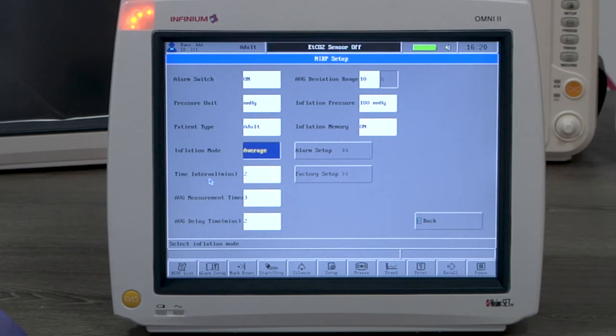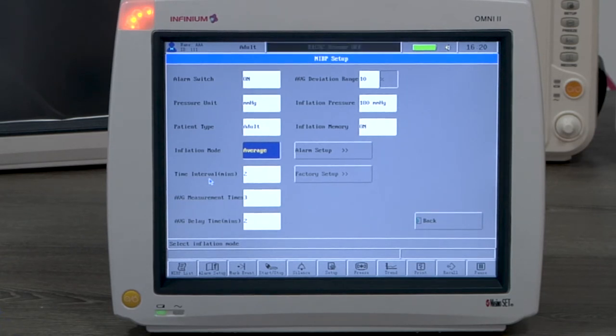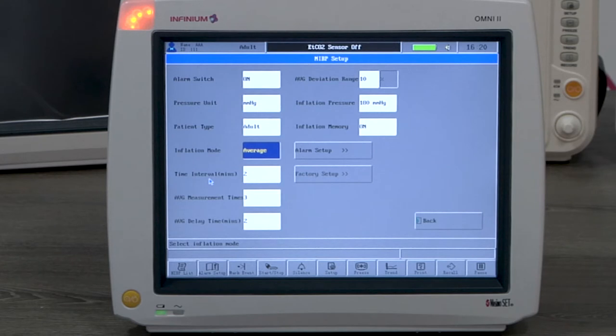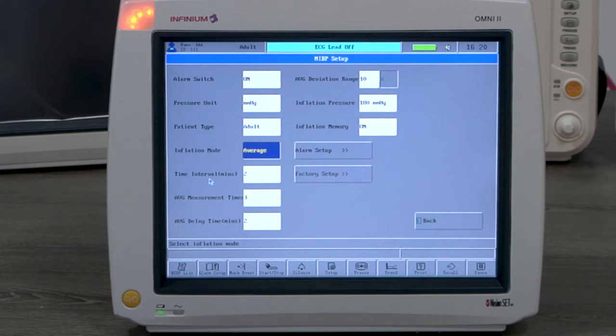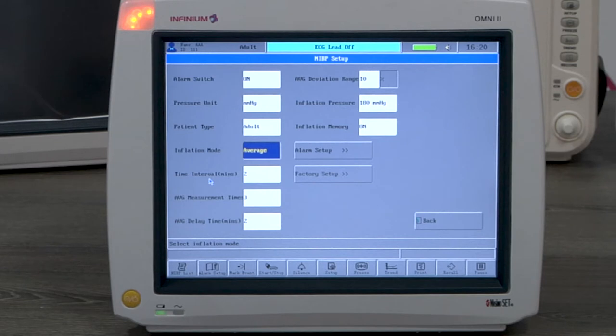If the first reading is a high BP, it will inflate to a high pressure at the beginning of a second measurement. This feature is helpful when monitoring the same patient or on a patient group that has similar blood pressure conditions.